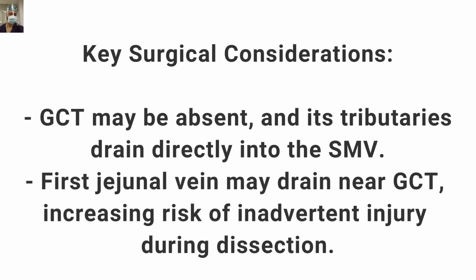There is no one thing which is common. There may not be any GCT. All these may drain independently into the SMV. The first jejunal vein may have a connection, or it may drain into the SMV very close to the gastrocolic trunk, and there is a possibility of injury by looping it.